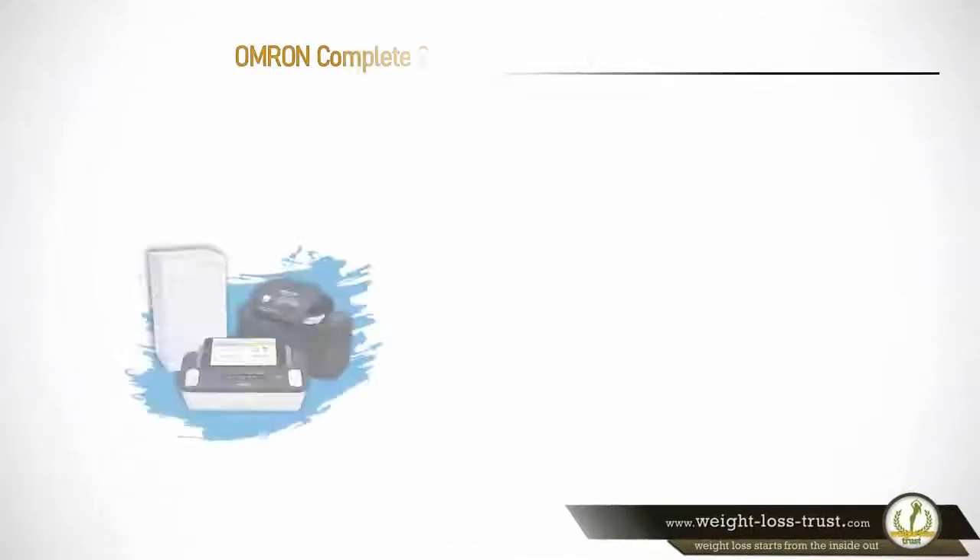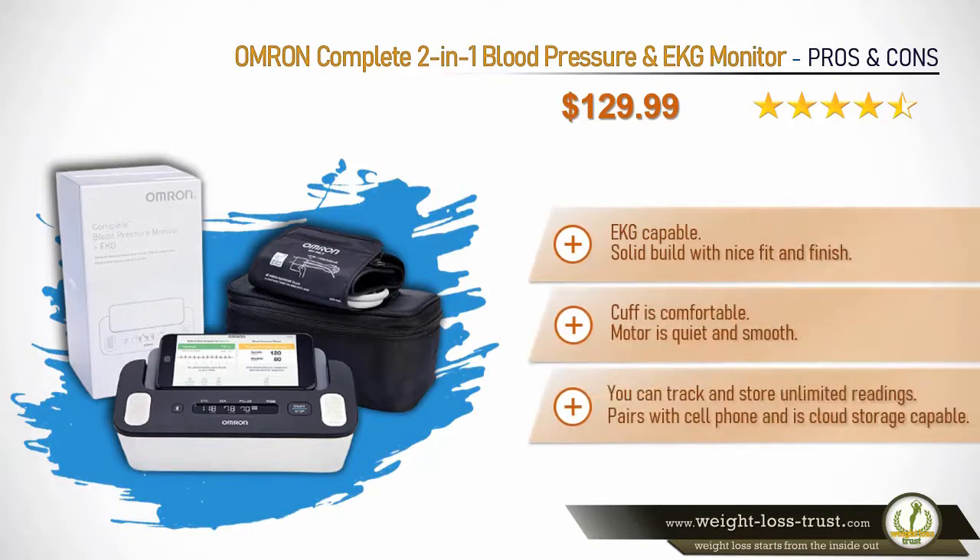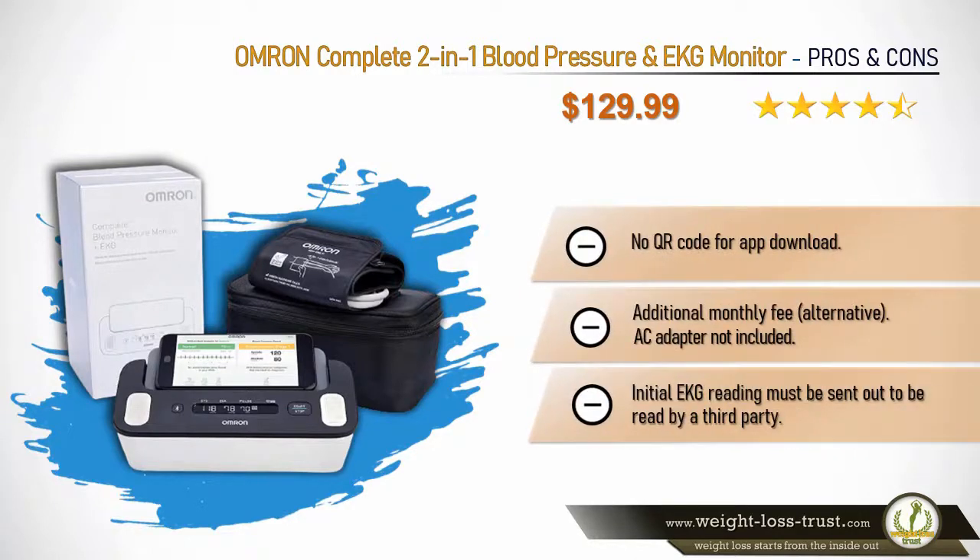Omron Complete 2-in-1 blood pressure and EKG monitor — pros and cons. Pros: EKG capable; solid build with nice fit and finish; cuff is comfortable; motor is quiet and smooth; you can track and store unlimited readings; pairs with cell phone and is cloud storage capable. Cons: no QR code for app download; additional monthly fee; AC adapter not included; EKG reading must be sent out to be read by a third party.